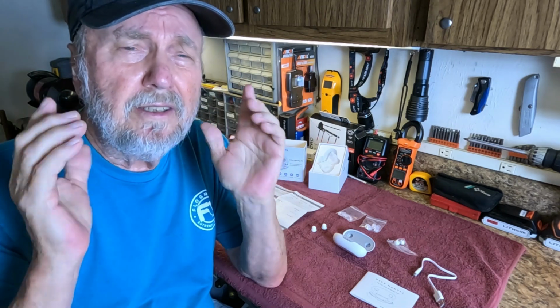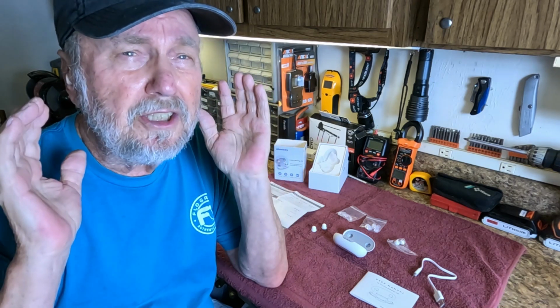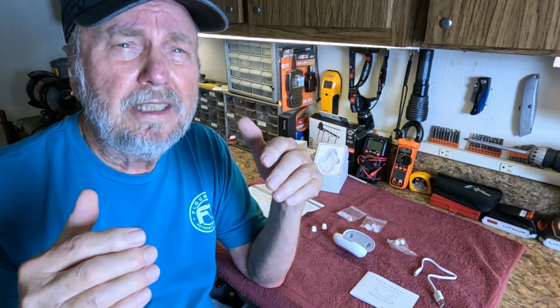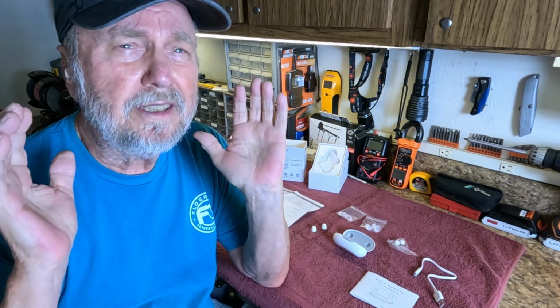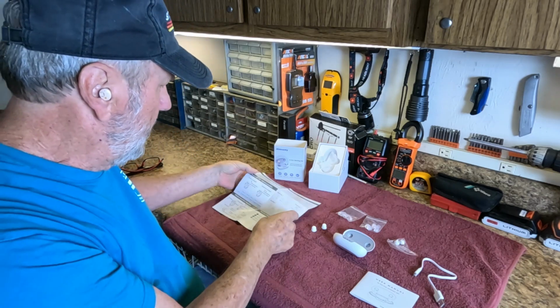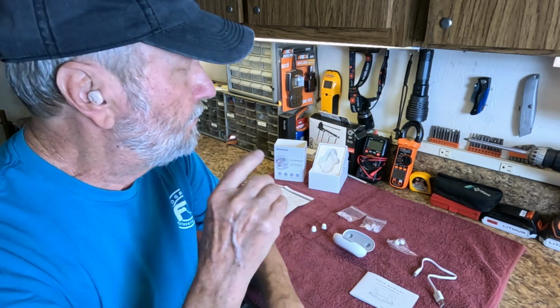Now, one thing, if you're a senior, you talk loud because you don't hear well. This kind of makes you talk lower because you hear yourself strong. So I'm holding my voice down a little bit. So you're going to find that right away. These things are nice. Okay, they're working, and we're going to go to the volume control.